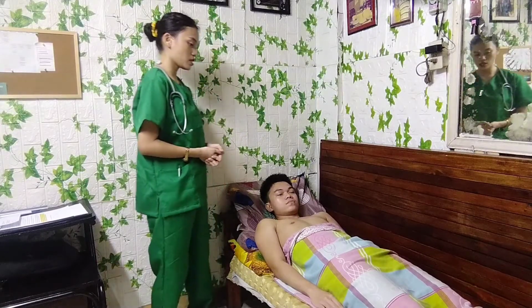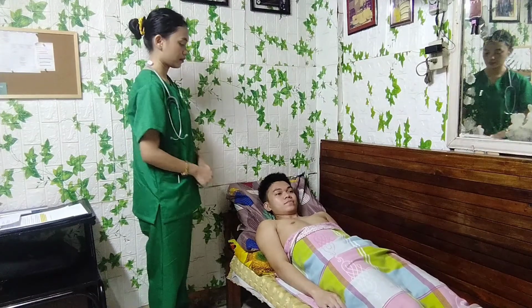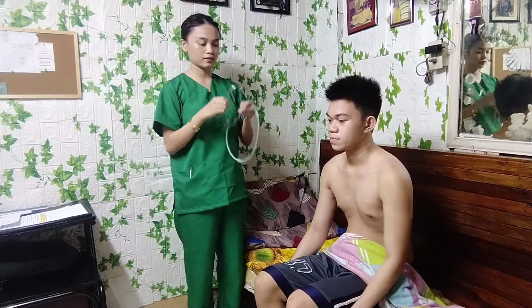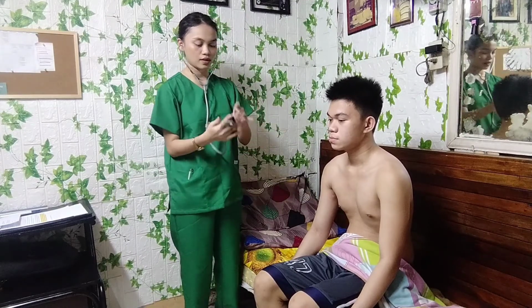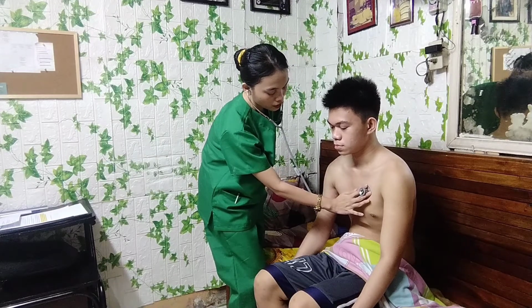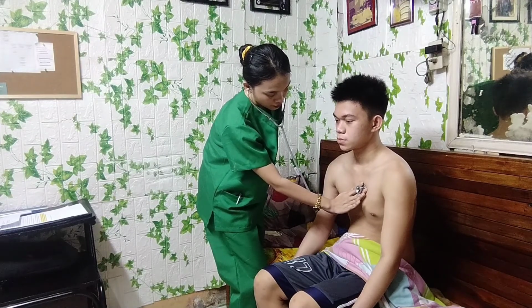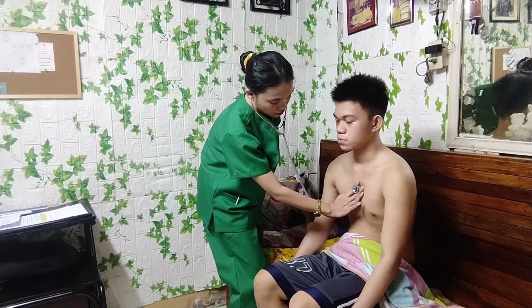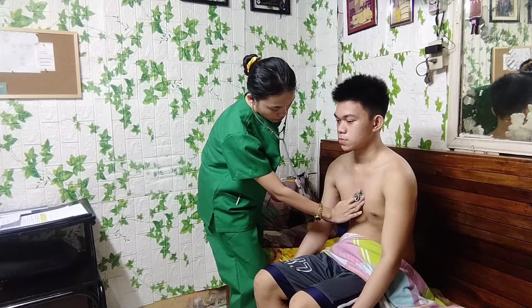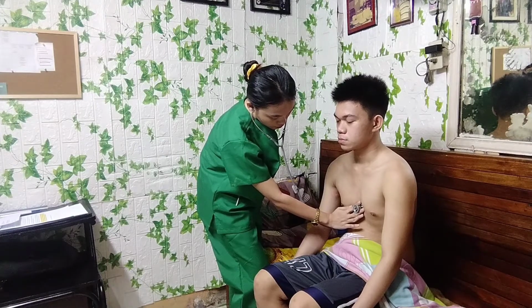So sir, please change to a sitting position so that I can auscultate your cardiac landmarks again. Okay. Let's begin again at the aortic area. Okay, the pulmonic area. Tricuspid area. Erb's point. The mitral area. And lastly, the apical area. Okay.